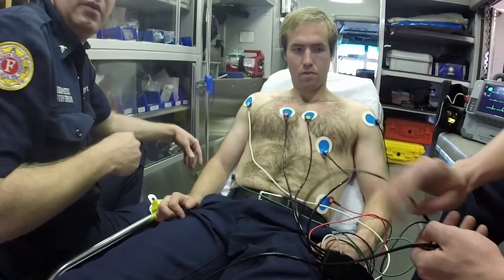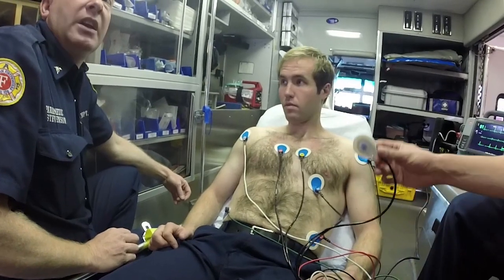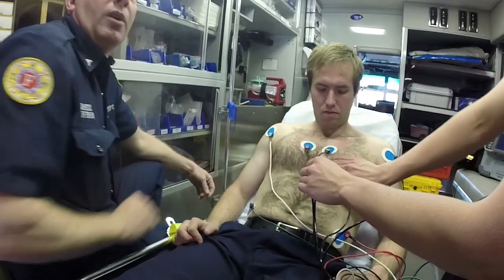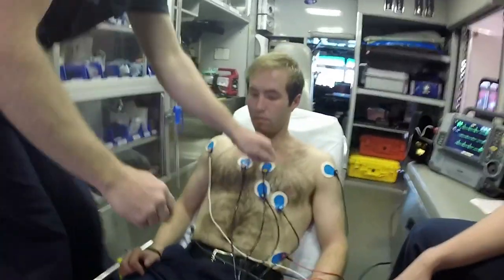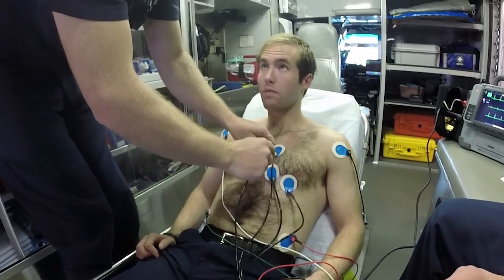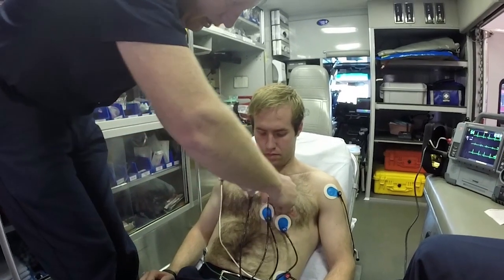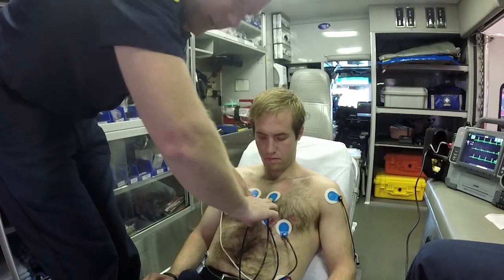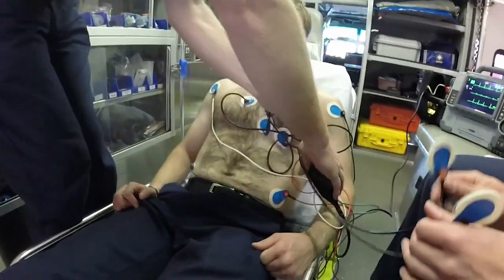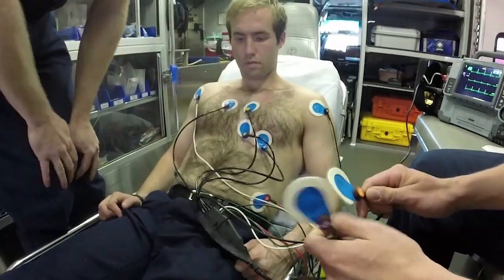That was really good input — being able to talk about lifting the bra to get V4 in there. That kind of stuff will be very helpful. I actually tend to struggle with V3 more because you'll have the shirt pulled up and this one you'll end up placing sometimes after, based on your logistics of putting V1 and V2 in and then trying to get V3 there. I usually do V3 from the top of the bra, and then the others will all be from the bottom.